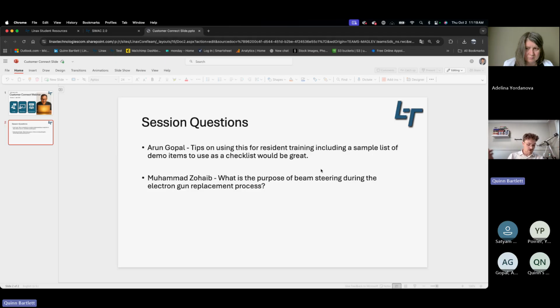And that's a great question, and really, it's going to be like that. Your beam source is being altered, right? So when you get a new gun in your Linac, your old gun is probably going to produce your source just differently because it's a very delicate thing, right? Our filament current produces electrons to inject into our waveguide. So every time you change a gun, they're not going to be 100% the same.